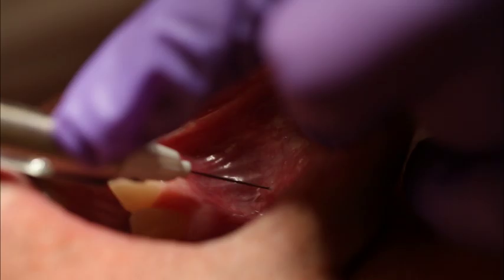The supraperiosteal injection can be accomplished on any tooth via deposition of the anesthetic solution adjacent to the periosteum overlying the apex of the tooth to be anesthetized. It is rarely used in the mandibular posterior teeth because of the density of the mandibular bone in adults.